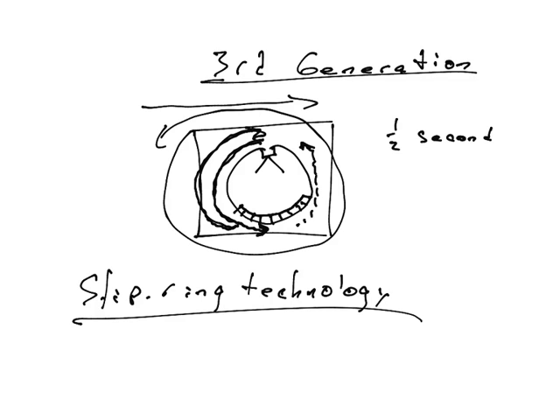Well, with slip ring technology, that allows you to connect power and wires and things without it being a solid connection. So instead of plugging the wire in, let's say, this is the rotational part, and on it is the little X-ray generator and the detectors and stuff.